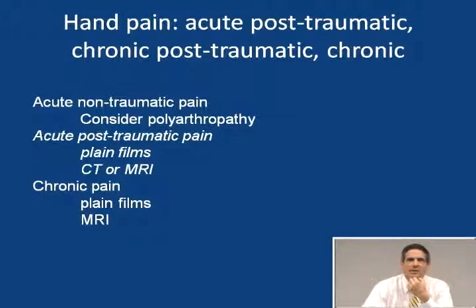How about hand pain? Well, it's a familiar refrain. Plain films first. You're looking for dislocation, fracture, foreign bodies, some combination of abnormalities.